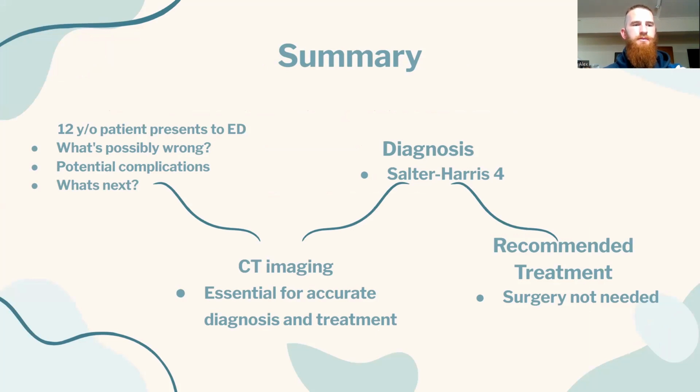In this case study, we have followed a case of a child being injured playing sport and their likely path through the healthcare system, with a focus on imaging. While the presentation of a broken ankle may appear simple, this case study highlights the potential complexities of fractures involving joints and the lifelong implications for the patient when it comes to choices of their treatment. CT imaging plays a major role in assisting professionals to determine the best course of action for their patients, as was the case for this patient, and as such, it is an invaluable tool.